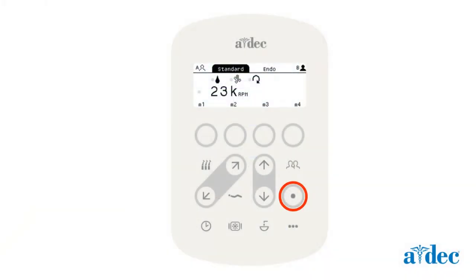When the Adjustment button is in use, a dot will appear to indicate which item is selected for adjustment. For dynamic handpiece modes, such as on an electric handpiece, keep pressing the Adjustment button to move the dot to the desired item. Use the chair base up or down arrows to adjust the chosen item. The Adjustment function will automatically exit after several seconds of inactivity, or when the foot control is pressed, automatically saving changes and returning to normal operation.